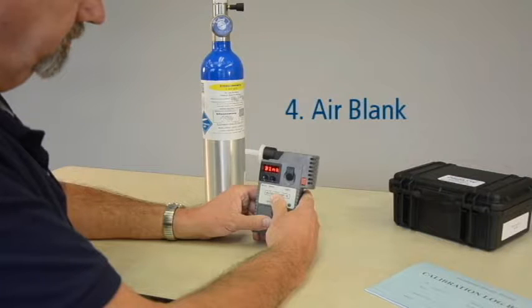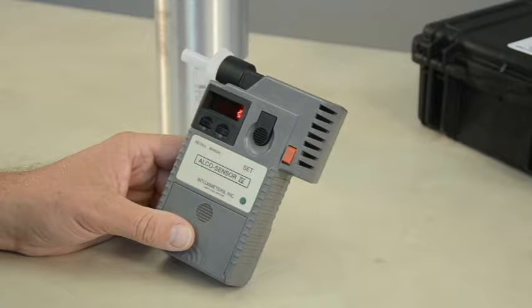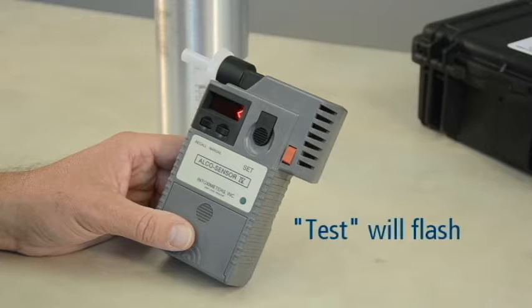An air blank is a procedure that checks the device for any residual alcohol that may remain from a previous test. If the instrument is free of alcohol, it will read .000 for a few seconds. After the device displays the air blank results, it will flash the word TEST.